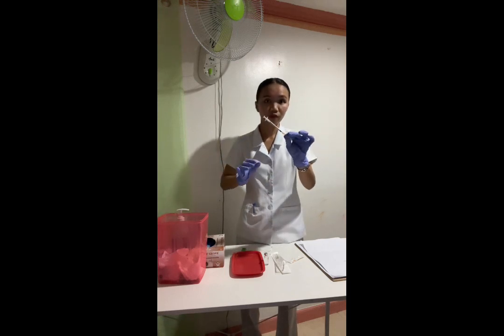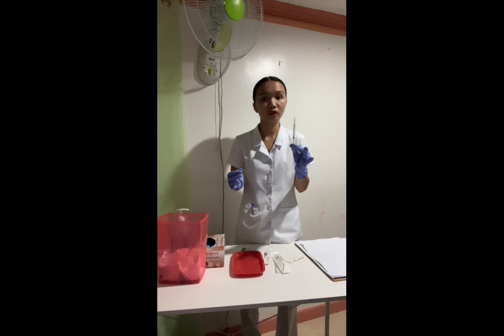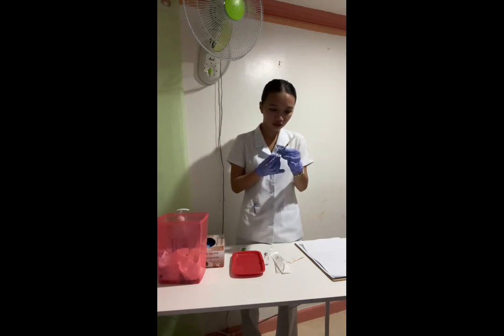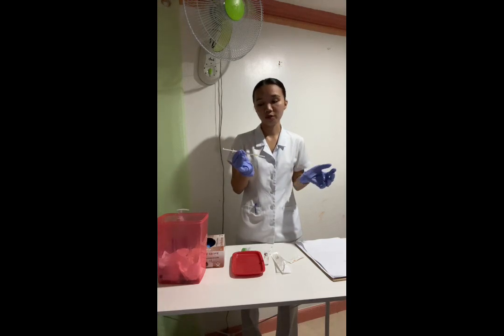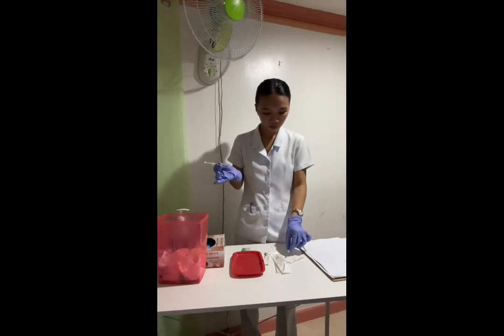And then we have to remove the cap from the needle, then draw up into the syringe the amount of air equal to the volume of the medication to be drawn. So after we draw the enough amount, we have to remove the cap.